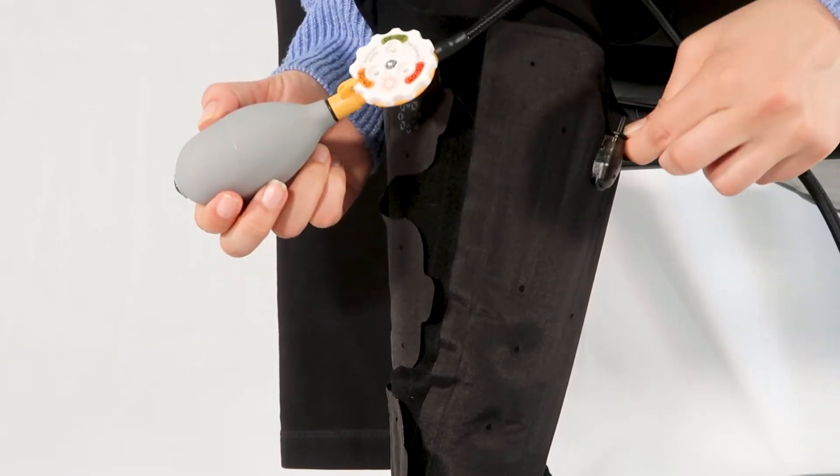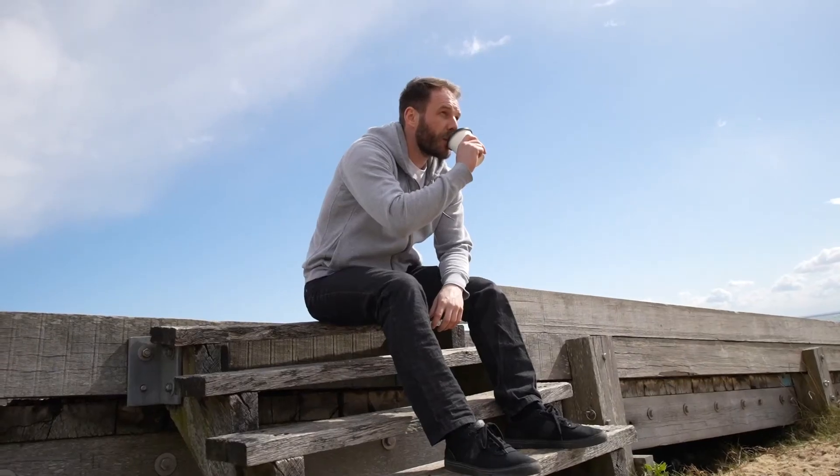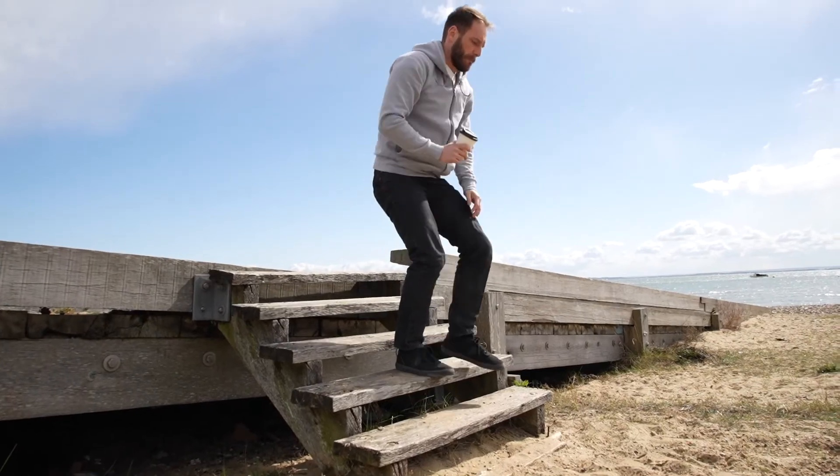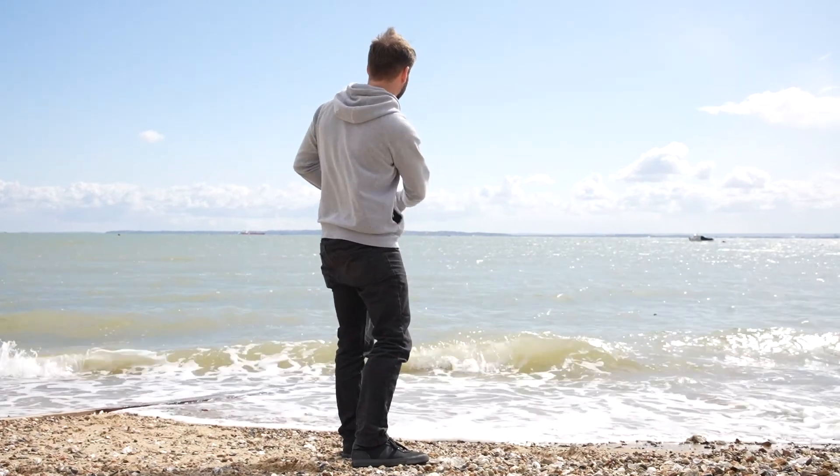Each AeroGauge range has a calibrated blow-off valve releasing excess air, maintaining the desired compression level. If you plan on wearing shoes while wearing the AeroWrap, you may find it easier to put the shoes on prior to inflating.